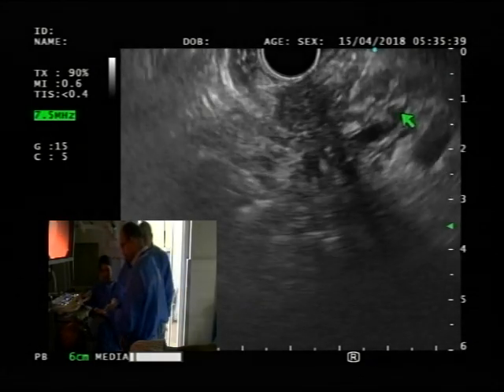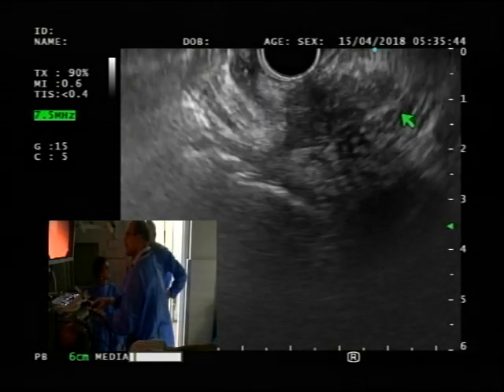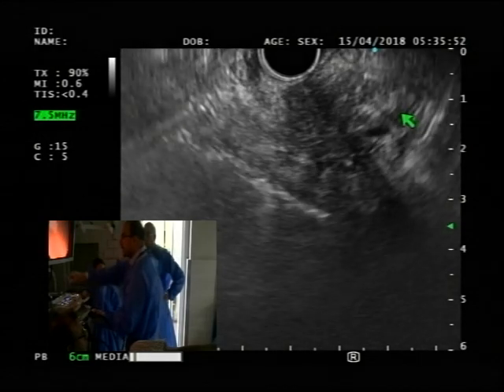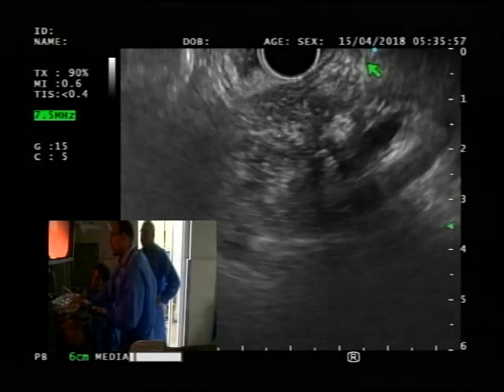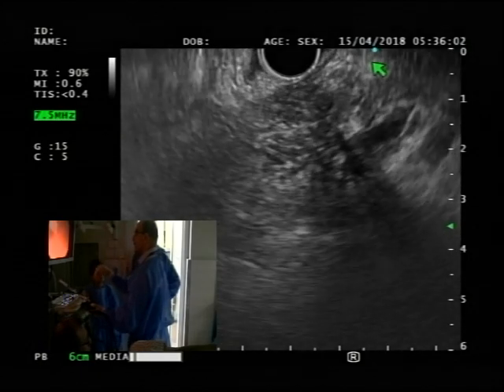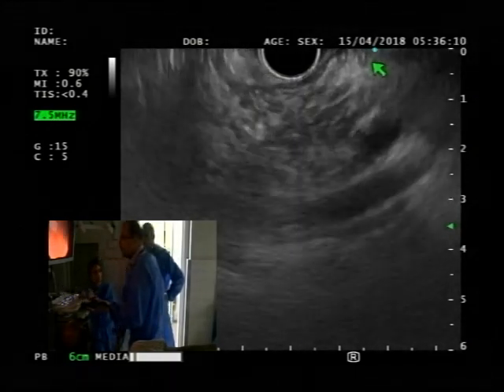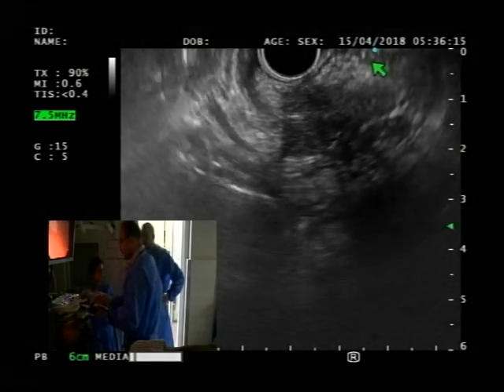Okay, this move that you do, this is the stylet outside. Let me take it out and show you. This is how far your needle is going to come out. Your needle sheath is going to come out. So this is the sheath right up here. What is its purpose? To protect, so you don't want it too deep in, you don't want to perforate through, and you don't want it too far back, because then your needle has to travel a long distance before it can actually get to the tissue of interest.